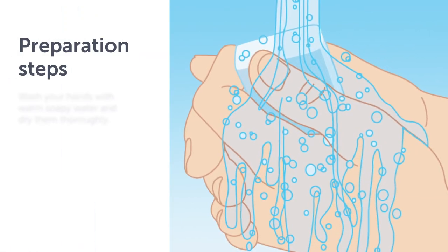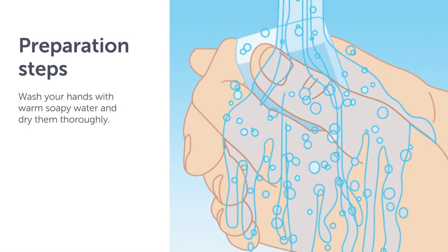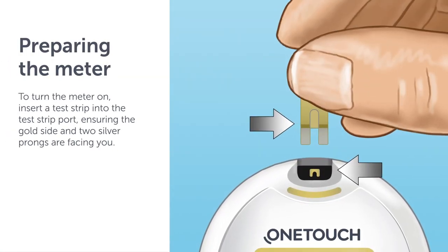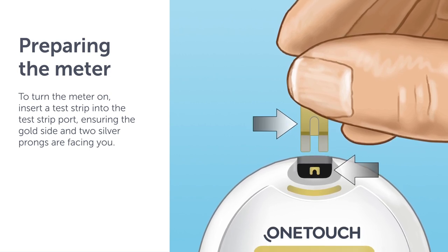Before you begin testing, prepare by washing your hands with warm soapy water and dry them thoroughly. To turn the meter on, insert a test strip into the test strip port, ensuring the gold side and two silver prongs are facing you.